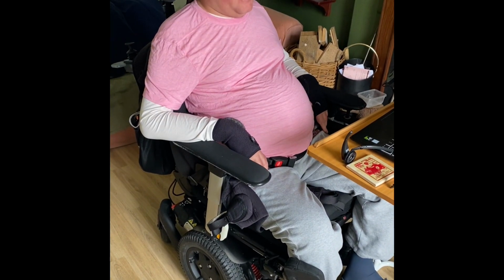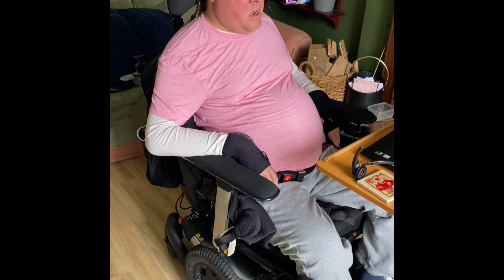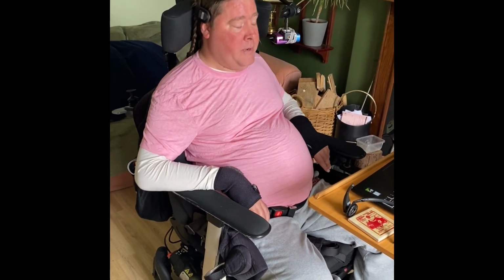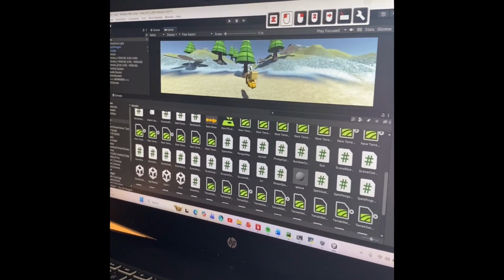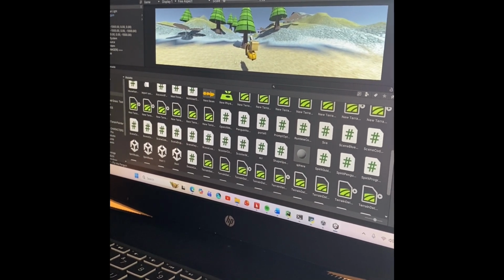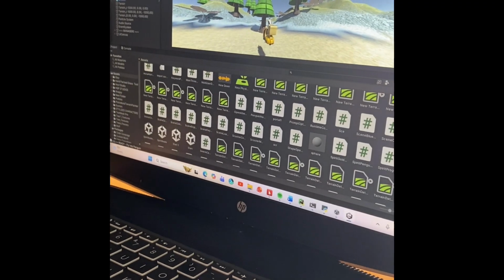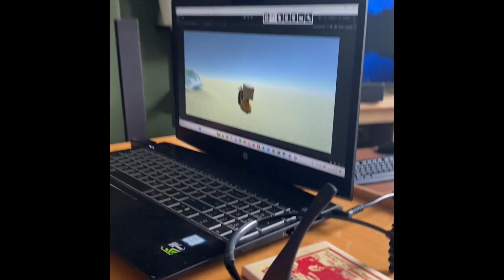For the flying aspects of the vehicle, I developed a simulation in Unity, allowing me to simulate the effectiveness of my aerial control system, both as a single standalone vehicle and the mapping of several vehicles at the same time. So if I show you the Unity, this is a little world I have designed, and the simple task at hand, if you see there's a scooter which is mapping the wheelchair and there's a penguin in the distance, and the trick is to navigate to the penguin in order to successfully demonstrate how the system works. So let me just make the screen bigger. So here it is. There's a dead zone in the middle.